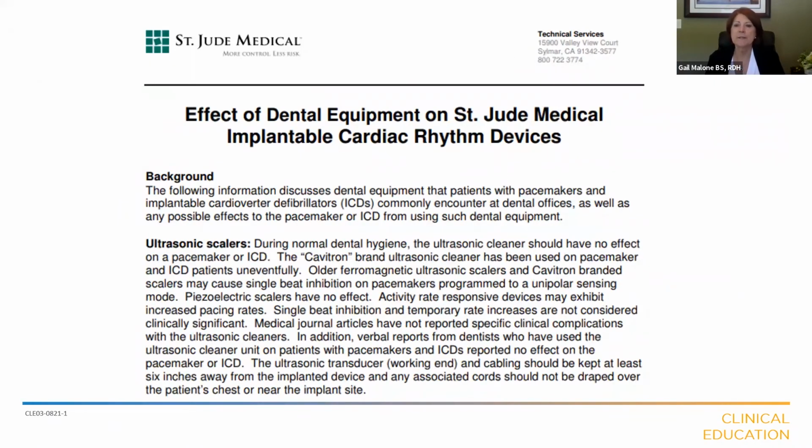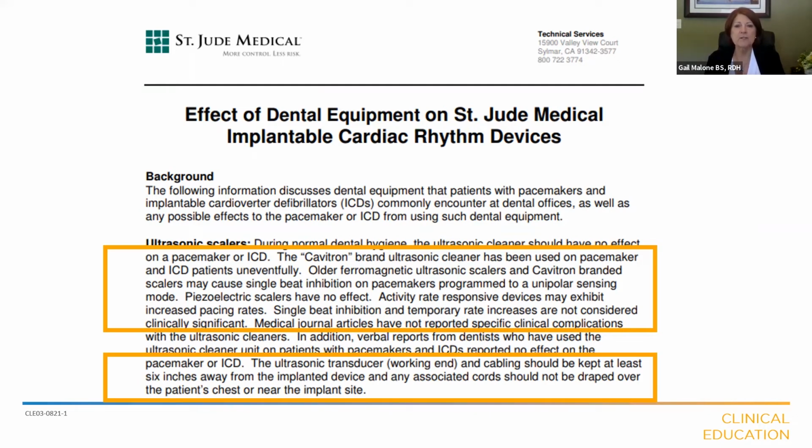St. Jude Medical, another leading manufacturer of these implantable devices, actually calls out Cavitron by name, stating that the Cavitron brand ultrasonic cleaner has been used on pacemaker and ICD patients uneventfully. It goes on to speak to the fact that the ultrasonic transducer, meaning the working end and the cabling, should be kept at least 6 inches, 15 centimeters, away from the implanted device, and any associated cord should not be draped over the patient's chest or near the site of the implanted device.